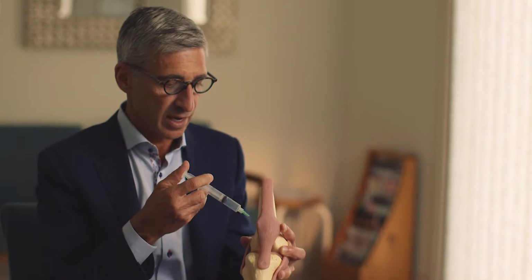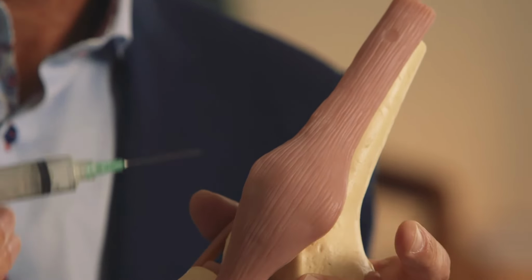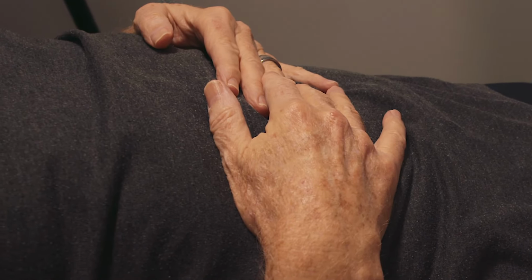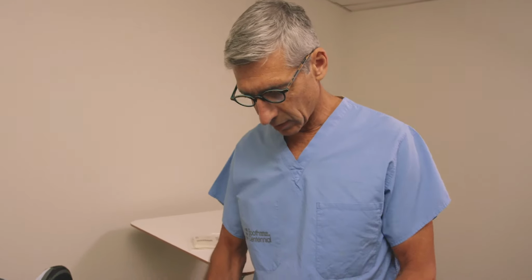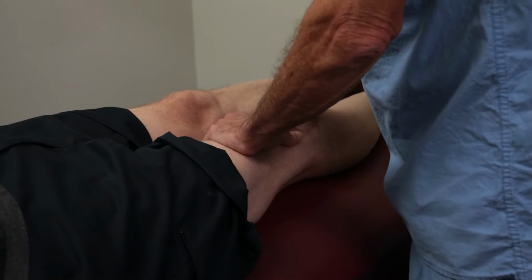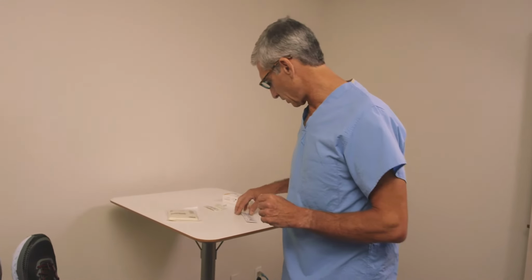I then inject and I look for a lack of resistance on the needle, so I know that the injection is in the joint. In preparation for the injection, it's important that the patient is supine and completely relaxed, and I have them put their hands on their tummy and relax the knee, making sure that the muscles here and the quads and hamstrings are completely relaxed. I'm then going to assess the knee to detect if there's any effusion, and so we'll do a ballottement test and then a milk test to make sure that there's no effusion present, and here there's no fluid in the knee, so we can go ahead with the injection.